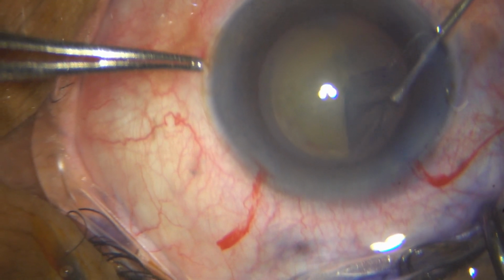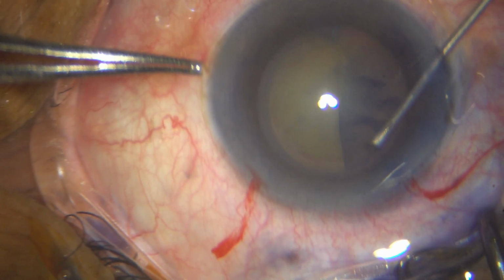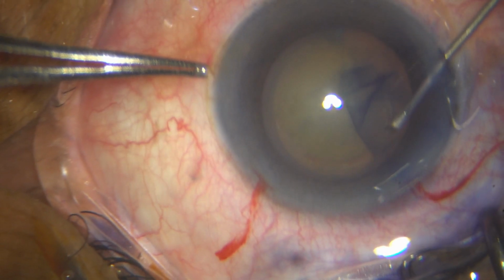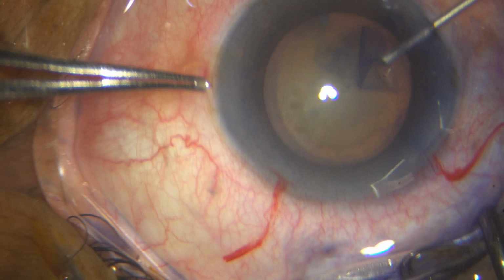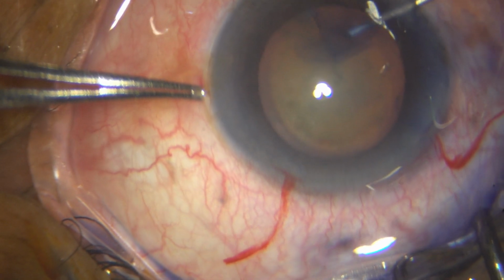I go ahead and fashion my 5.5 mm rhexis with my bent 26 gauge needle, and that's a pretty adequate rhexis.